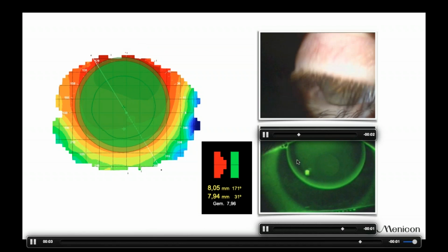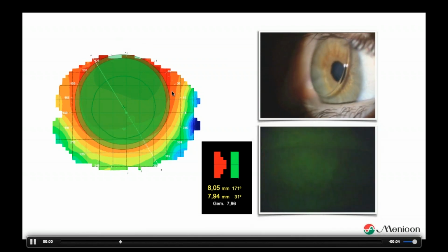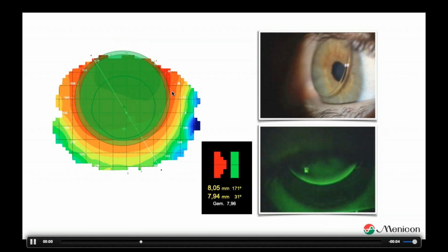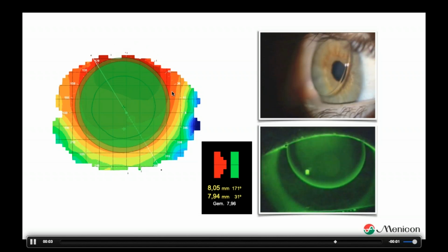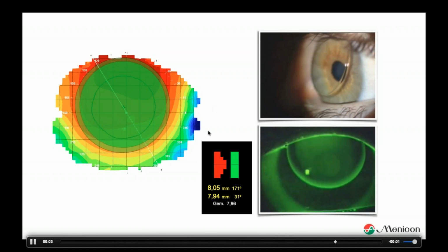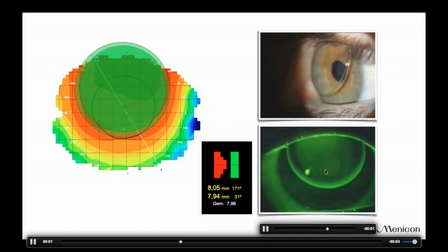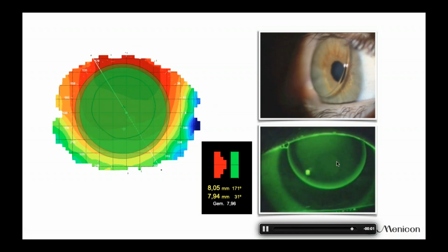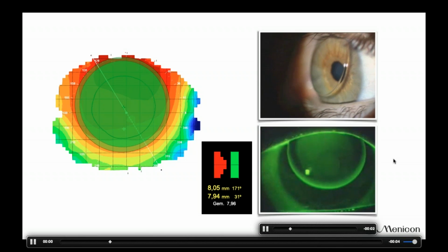And we know beforehand that this will be the case. So either manage the expectation of the customer, or maybe make another decision. Say, okay, I have to go to soft lenses in this case, or we give it a try and do something else. But again, you know the information up front, and I try to prevent doing this. By all means, try to get the lens centered, because I don't respect the cornea anymore. I want to stay away from that.